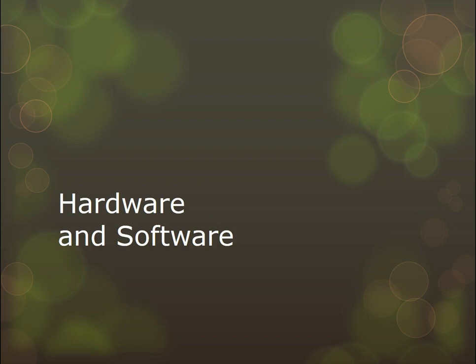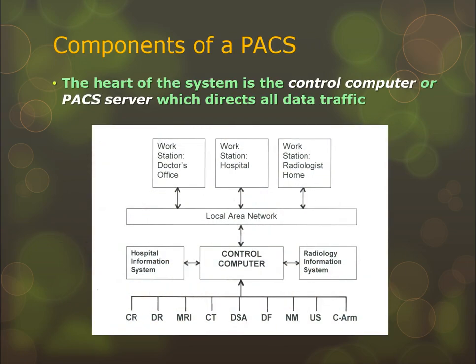Okay, now let's talk about the hardware and the software involved in the PAC system. The heart of the system is the control computer or PAC server, which directs all the traffic. So you see the control computer sits right here. You have all the modalities down here. They talk to it through DICOM.